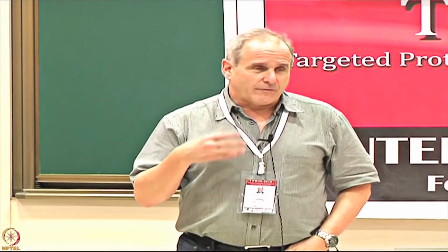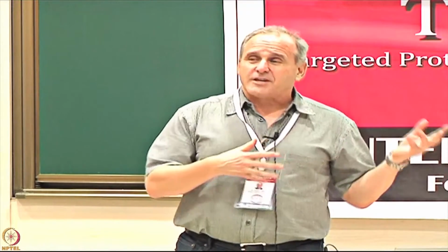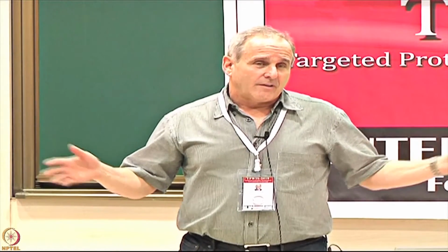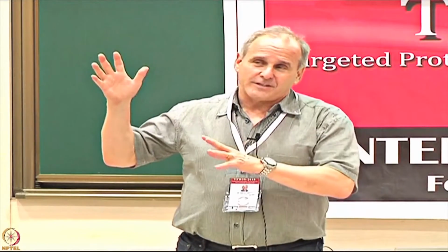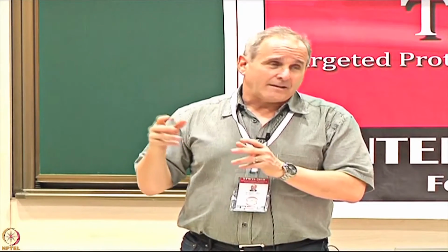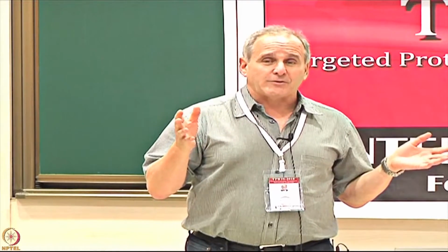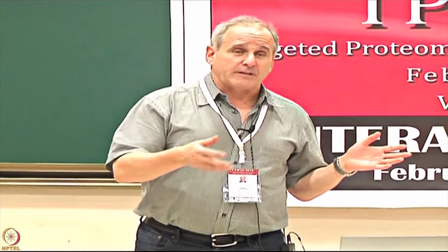All right, so then one of the things that we want to do is we want to be able to validate the results we get from our discovery study. So we talked about this a little bit earlier today. The discovery study, the observed difference, right, that we talked about, typically, in the early stages of a biomarker study, you're going to begin by looking at a large number of possible variables. You're going to look at as much of the proteome as you can get your hands on, right? So that leads you to this issue of potential overfitting, but it gives you the advantage of having searched as much possible experimental space as possible to find any marker that's going to be predictive for your disease.